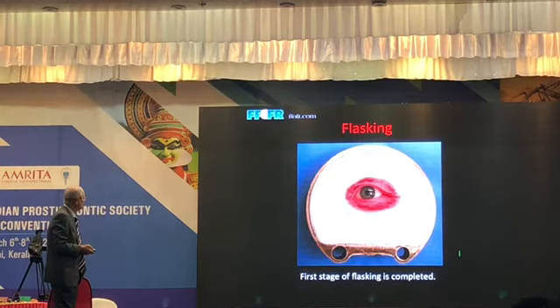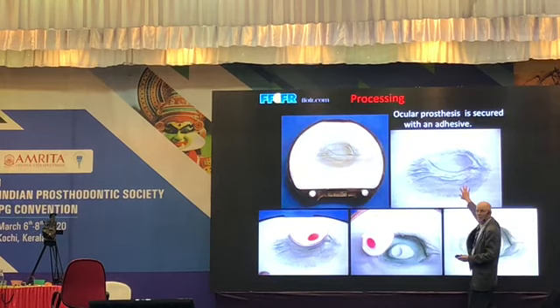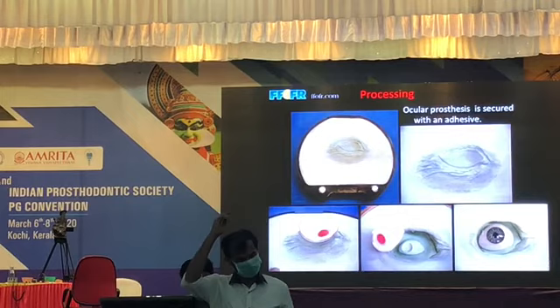So here it is totally flasked, and you separate. You can kind of see the detail associated with the surface texture. And it's much more prominent than what you would see in the skin. And of course you have to paint those lines with dark colors, grays and dark browns, in order to create the semblance of the skin folds.